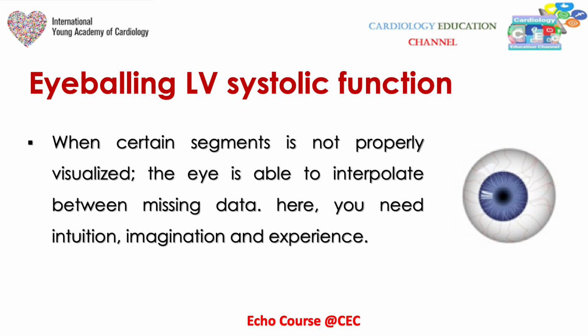And when certain segments are not properly visualized, the eye is able to interpolate between the missing data. You are like drawing an imaginary line of the myocardium in your eyes. The eyes don't accept missing points, so it's directed by an imaginary line that gives you an idea about the whole function. And here you need intuition, imagination, and experience.